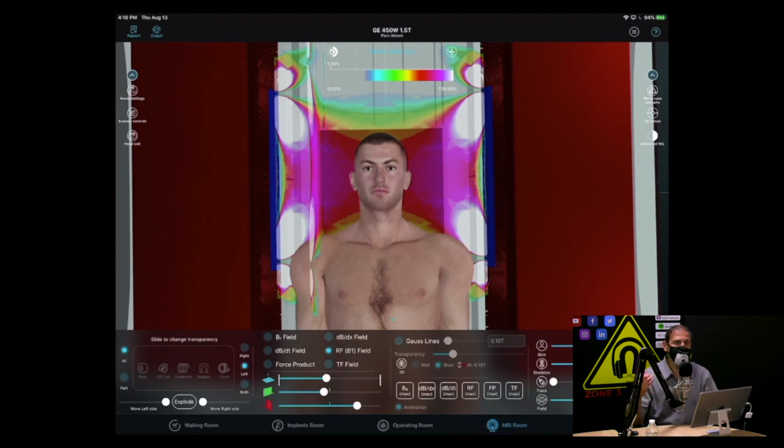It's multiple energies, but more than that, the energies are not used the way we're used to thinking of them. I don't just shine ultrasound at your liver. Give me my picture. I distribute these energies in such unusual patterns, and the risks are distributed in these unusual locations. It's entirely possible if this person had a wire right now that was in his neck, and the other end of the wire went to his ankle, I can cause a third-degree burn on this guy's ankle. In this position, exactly as you see for a pituitary study.